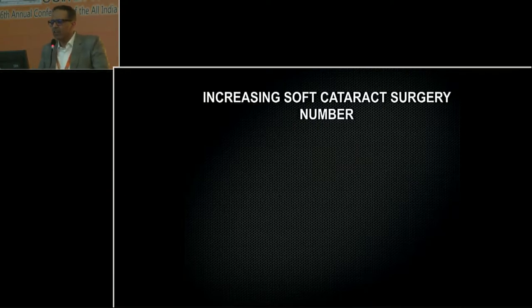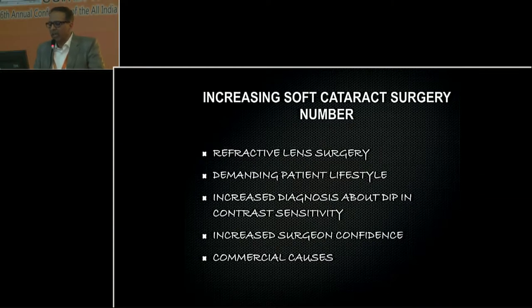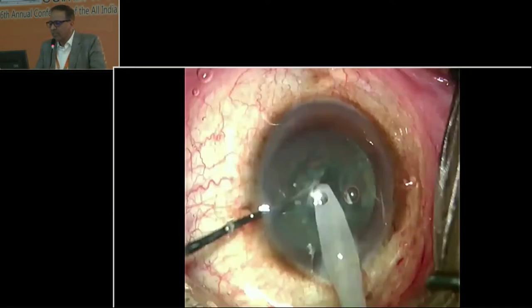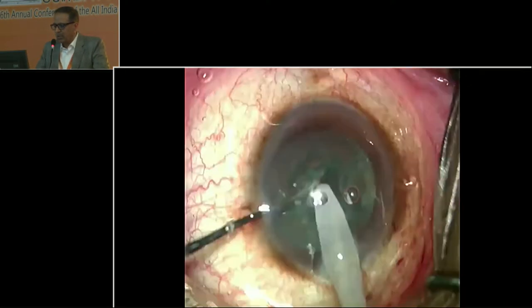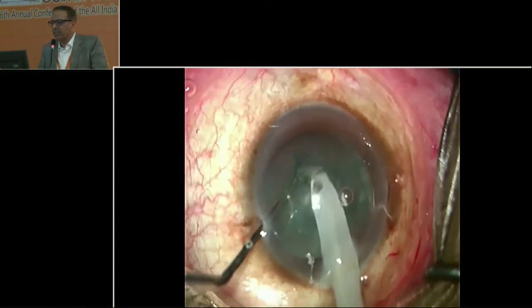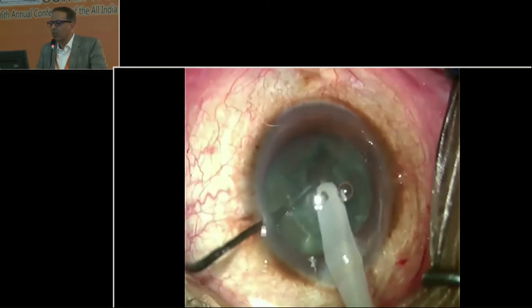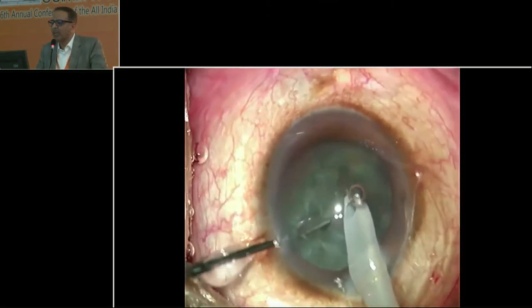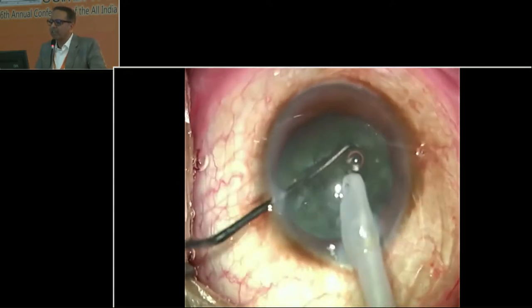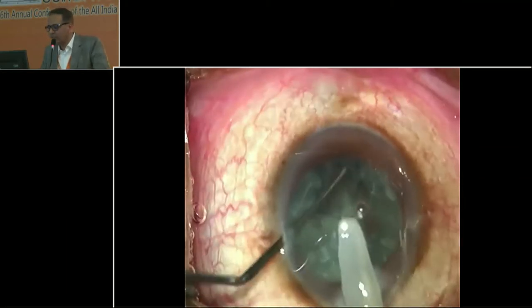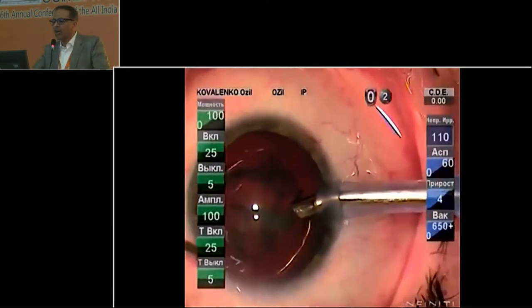Dr. Rohit now presents a rapid technique for soft cataracts. Thank you to the organizers for the opportunity. There are increasing numbers of soft cataract surgeries, and we have problems with them because we are not used to doing soft cataract emulsification — fragmentation techniques tend to cheese-wire through the nucleus, and when trying to hold pieces, you end up aspirating them.